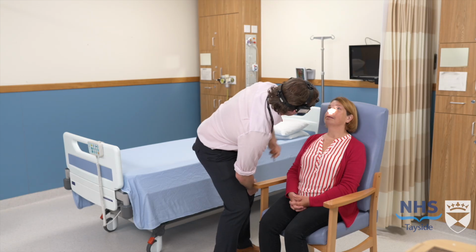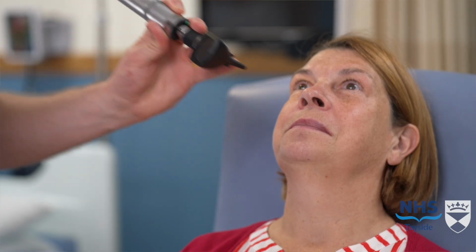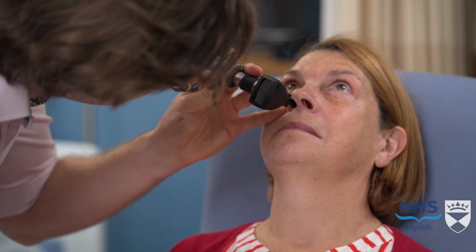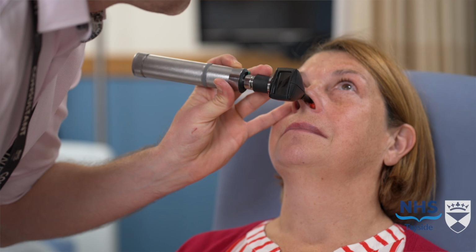When there is significant mucosal edema, you may just be limited to the septum and inferior turbinate. The septum is never straight, but you should be able to see and comment if there are significant deviations in the septum. The inferior turbinates are often mistaken for nasal polyps.